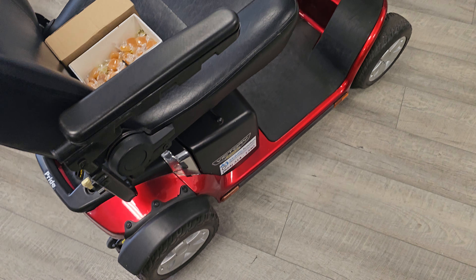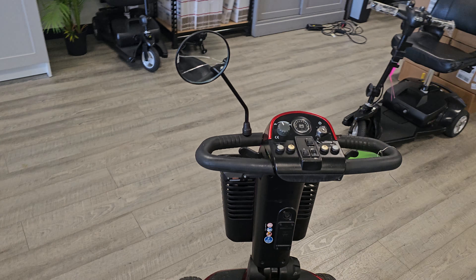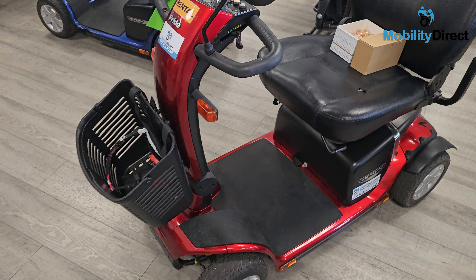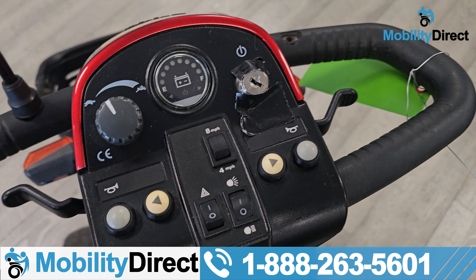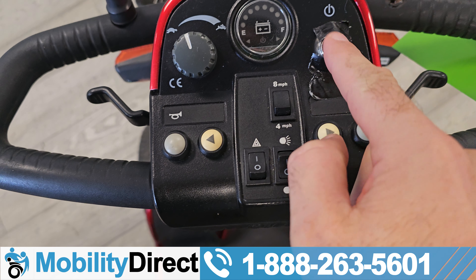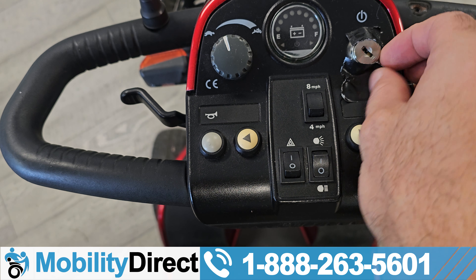Hi everyone, it's Drew with Mobility Direct. Today I want to give you a quick four-minute video on a very common repair on a Pride mobility product. This applies to pretty much most Pride mobility products that have this ignition — the Go-Go, the Victory, the Pursuit, any style.